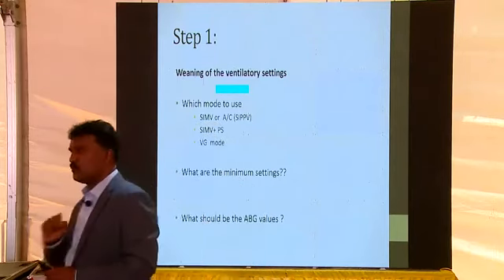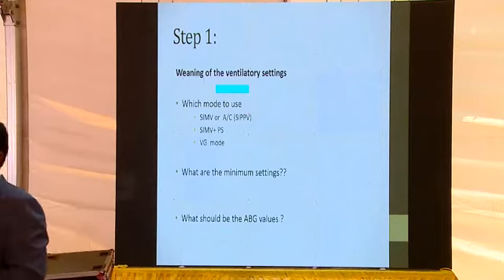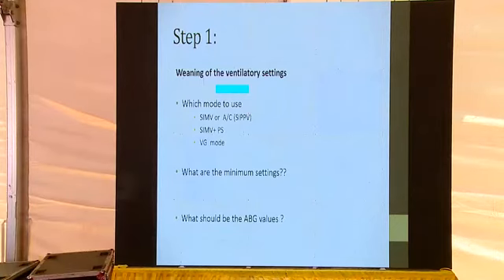Yes. So what is the problem? Why is pressure support not used as a primary mode? It is a good weaning mode. Pressure support has been very popular for chronic lung diseases, I would say chronically ventilated babies, BPD babies. Pressure support is a good mode in that, but it is not good as a primary mode.